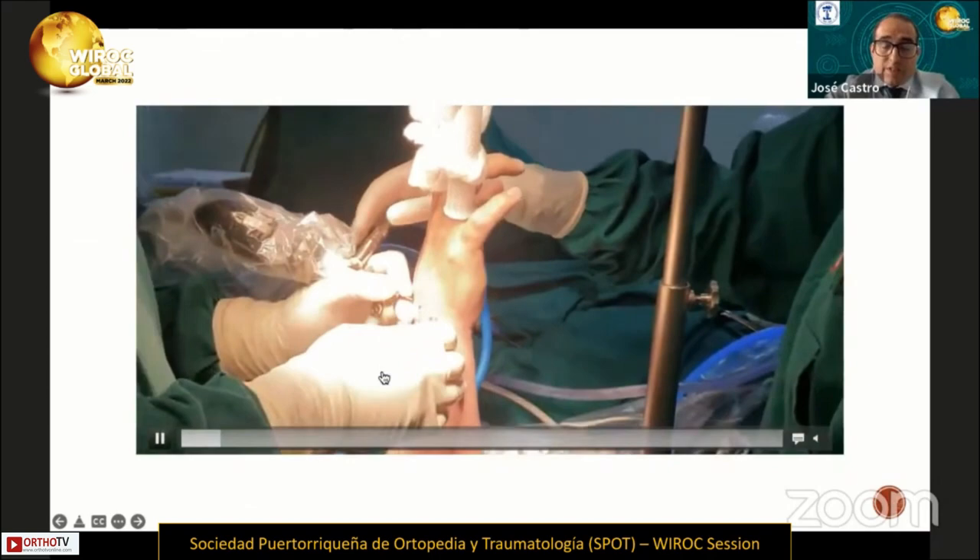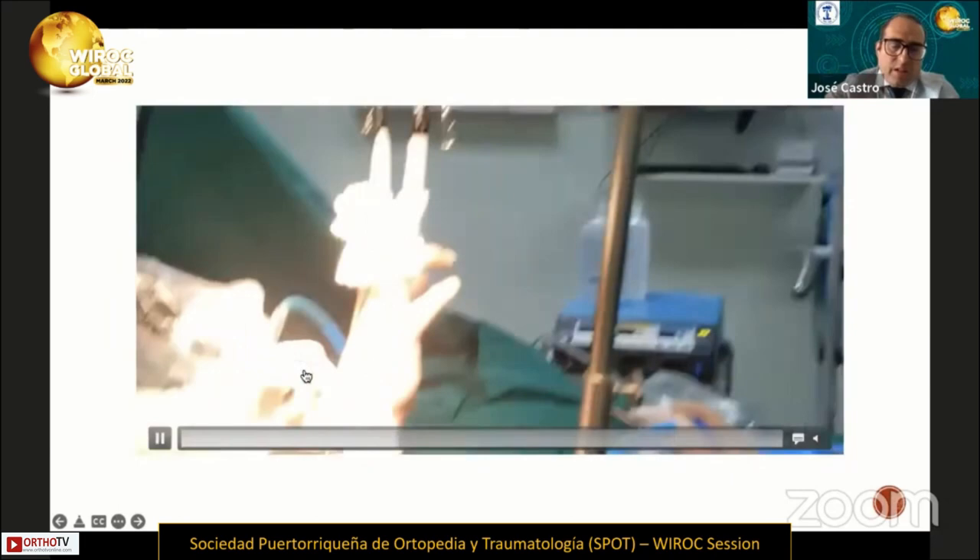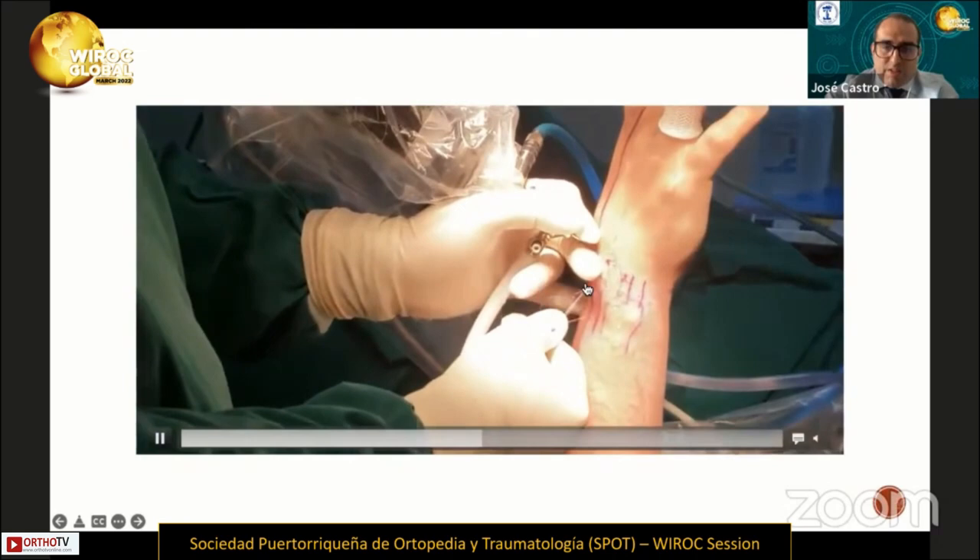We performed the knots. The first knot is tied between the distal ends of the sutures, as we can see in the video. The first knot then enters the midcarpal space.